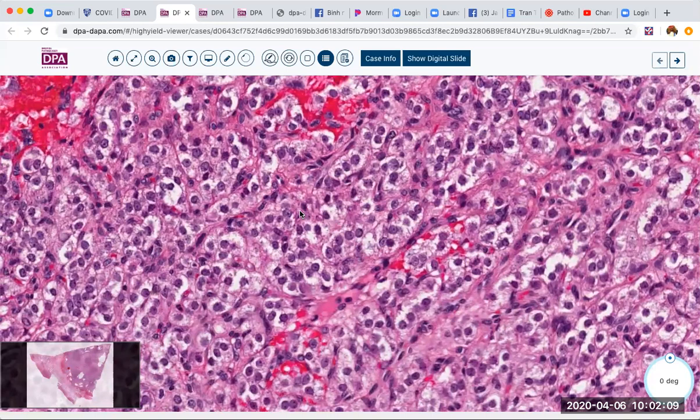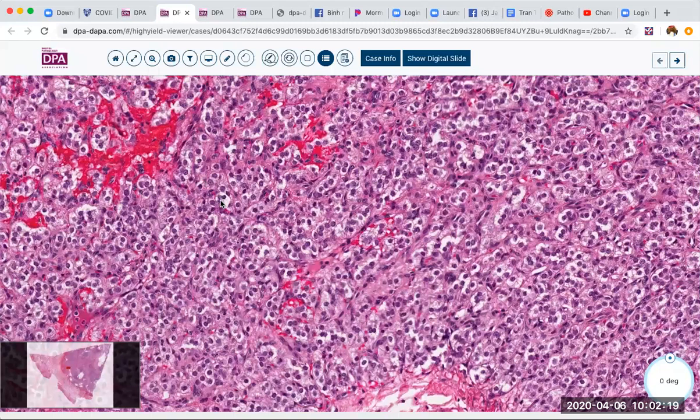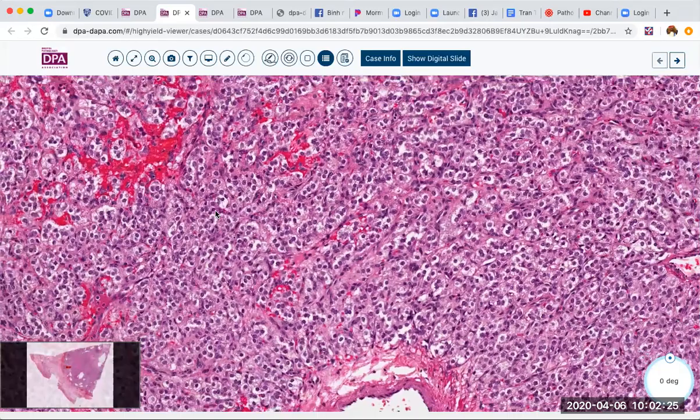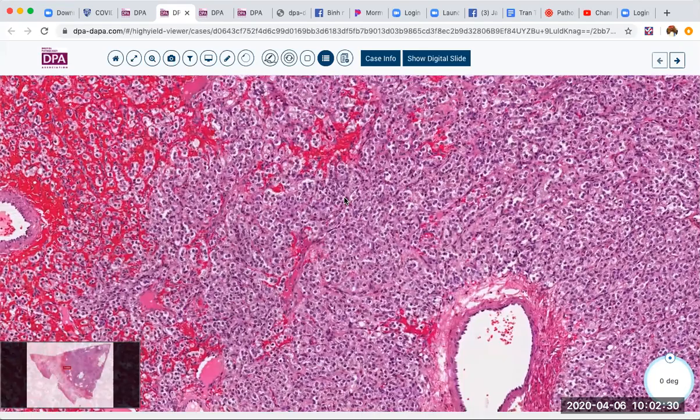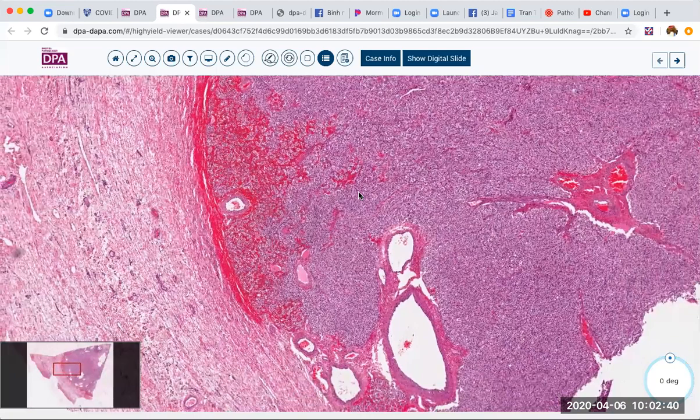What sorts of tumors in the ovary will give you this sort of appearance? We might think about Sertoli cell tumors as a possibility — they can have clear cytoplasm, fairly uniform nuclei, and a packeted appearance. Granulosa cell tumors also can have a packeted appearance, but we'd usually expect to see more follicular-type structures and maybe a little bit more multi-nodular appearance.